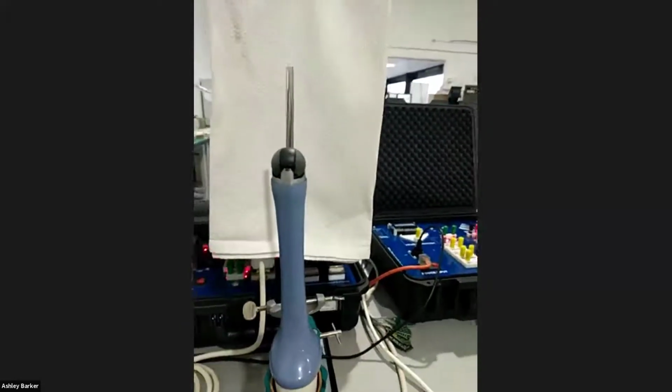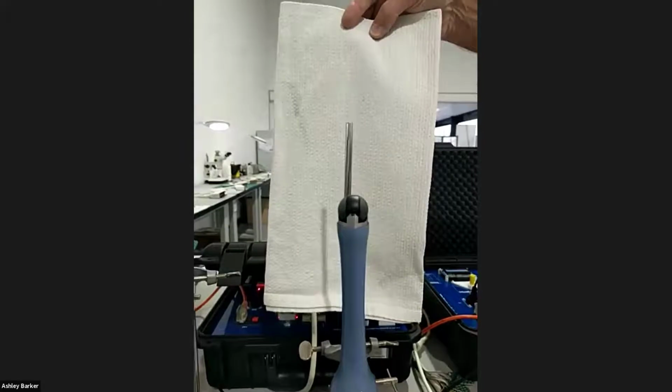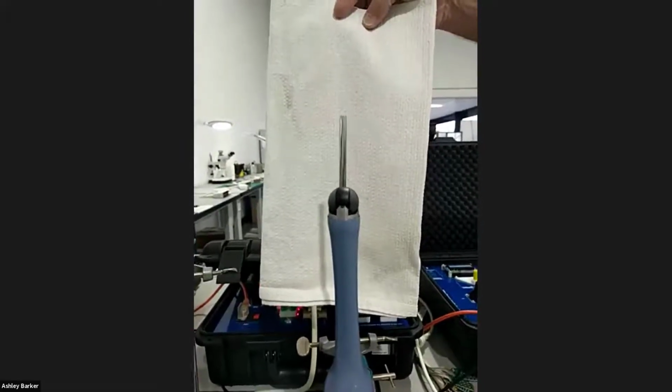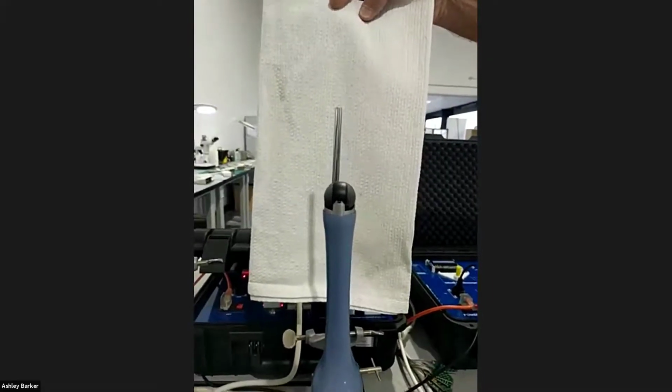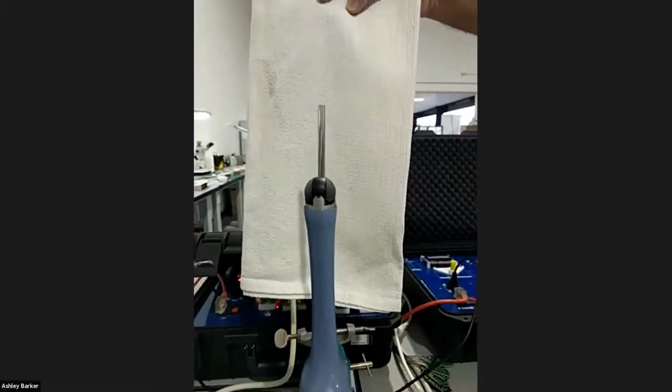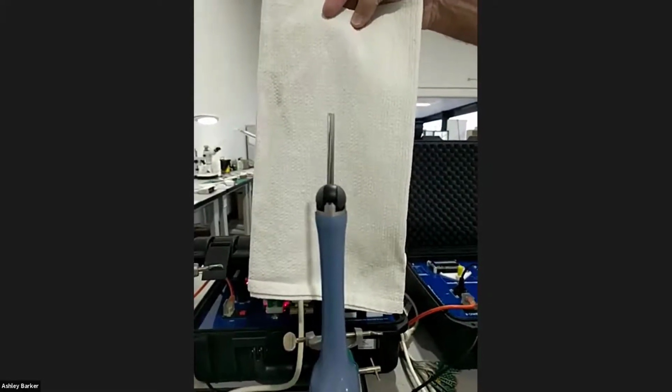You would never have dropped anything on a transducer, would you, Sue? Oh, never. No, but I've always worried much more about the transducer end than the cable end. Then I've seen the inside of that and gone, oh my goodness, look at how many micro parts are in there. I would say there's much less risk if you drop the connector end. Although there are lots of parts in there, they're all just electronics, and in terms of receiving a shock, they're not going to be anywhere near as upset as at the actual probe end.